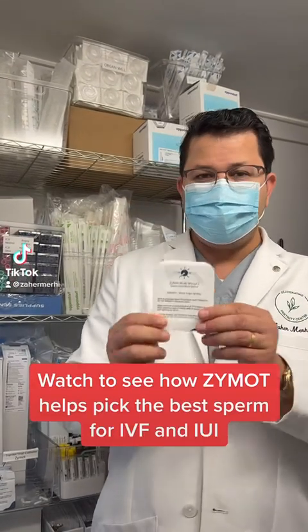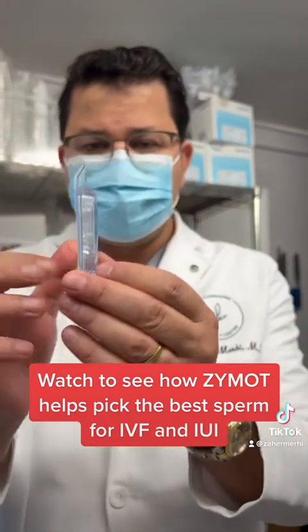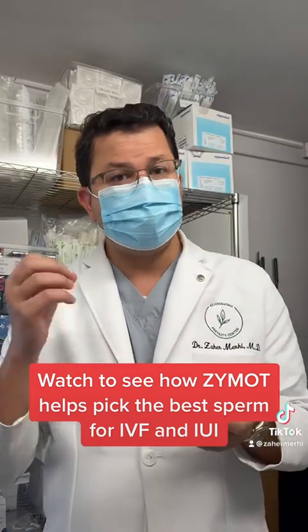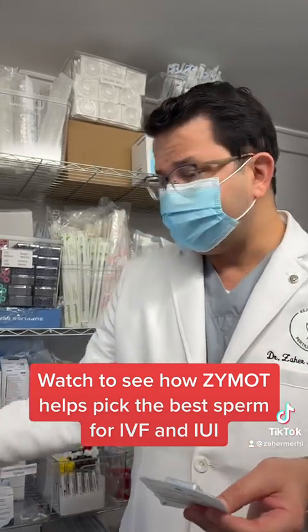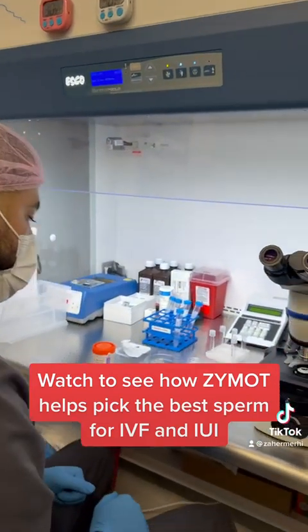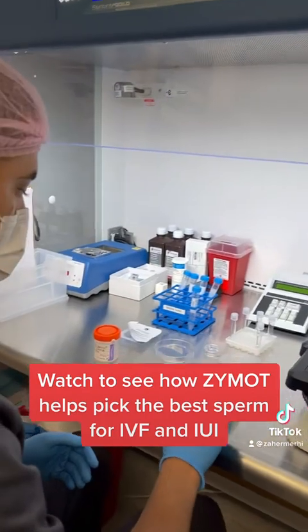Hello everybody, today we're going to talk briefly about the Zymot. The Zymot is a kit for sperm that typically chooses the best quality sperm for us to use during an IVF cycle or an IUI cycle. We have Anthony, one of our andrologists, who is going to show us how the Zymot is used in order for us to pick the best sperm.